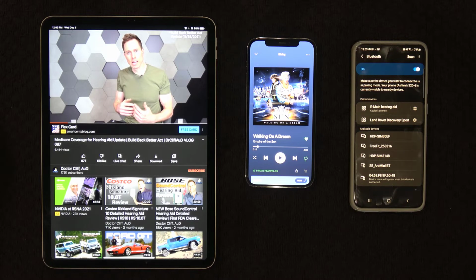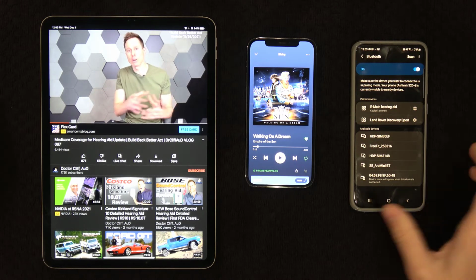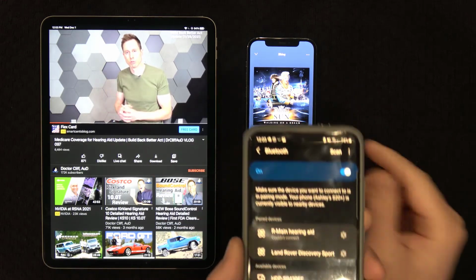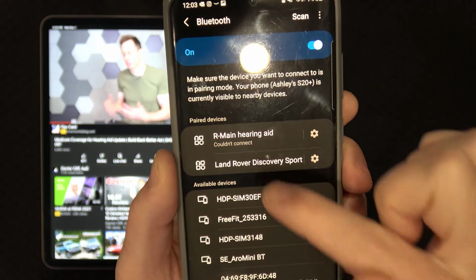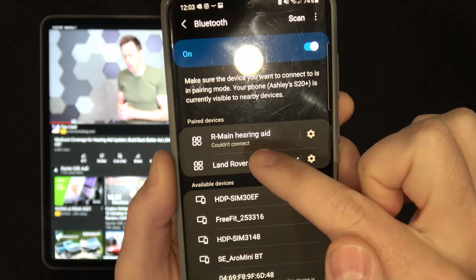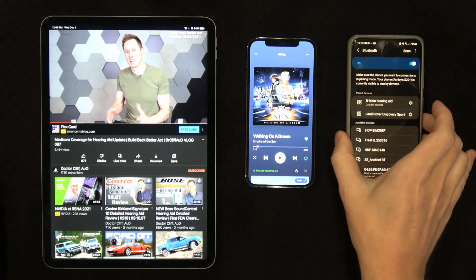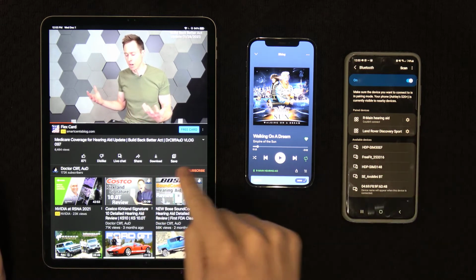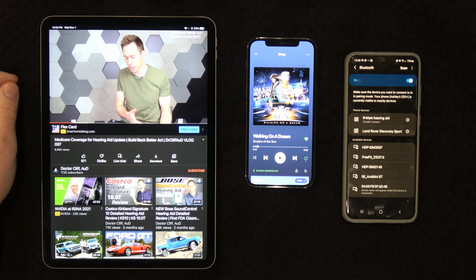But now, let's say you have a third device, in this case an Android phone that you might need to use for phone calls or whatnot. Since we already have these Paradise hearing aids connected with the iPad and the iPhone, we can't just tap on the name of your hearing aids on the third device, on the Android phone, because we're already connected to these first two devices. In this case, we need to disconnect the hearing aids from either the iPad or the iPhone in order to free up one of the two available connections in these Paradise hearing aids.